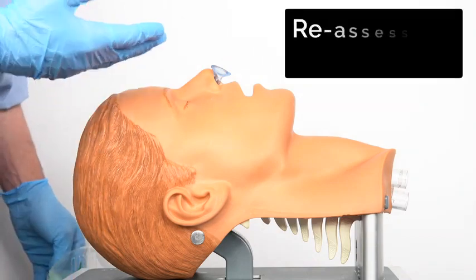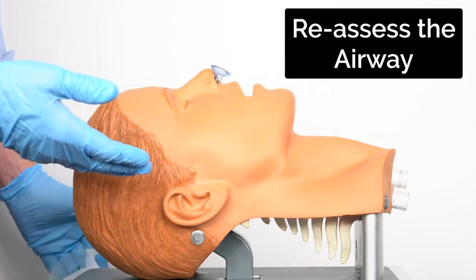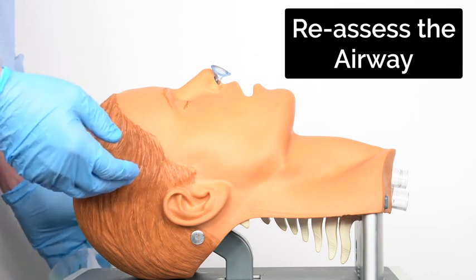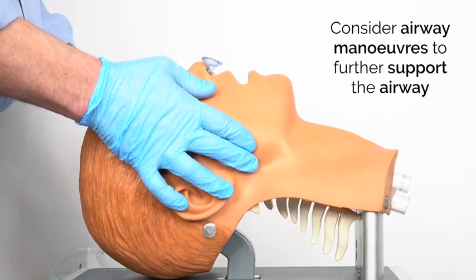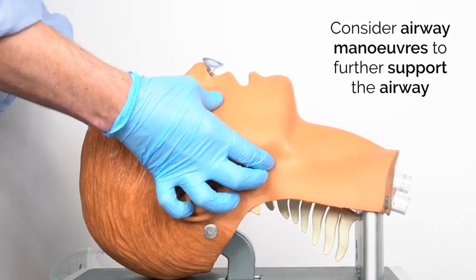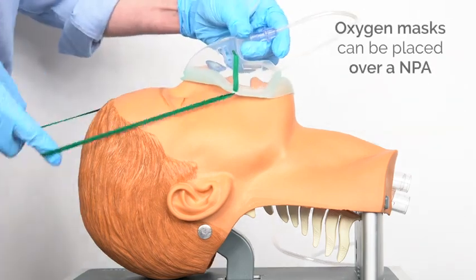Once the nasopharyngeal airway is in, it's important clearly to reassess the patient and make sure they have a patent airway and this is allowing them to ventilate. You may, even with this in, still need to do some simple airway opening manoeuvres to help support their airway. And also once it is in, you may need to support the patient by giving them extra oxygen.